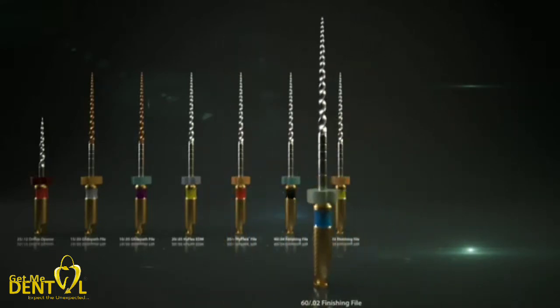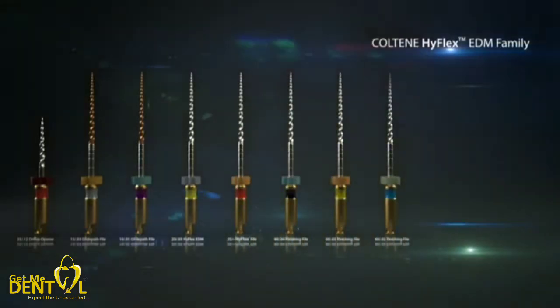With the use of the more maneuverable shorter files, comfortable working and superior preparation in a limited working space has become straightforward. Also new to the range are the HyFlex EDM 20-05 preparation and the 15-03 glide path files, allowing even more complex canal anatomies to be completely prepared with the efficient EDM files.